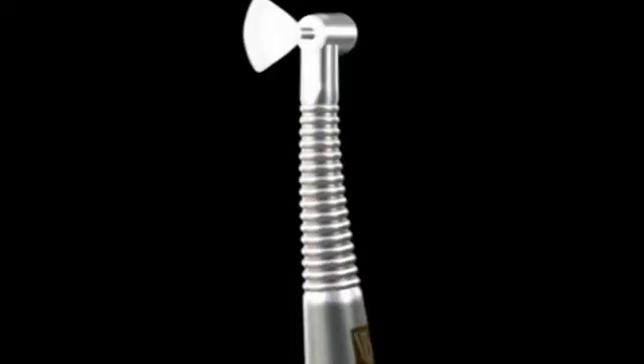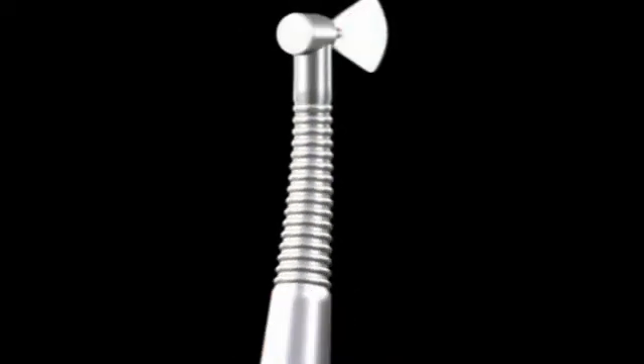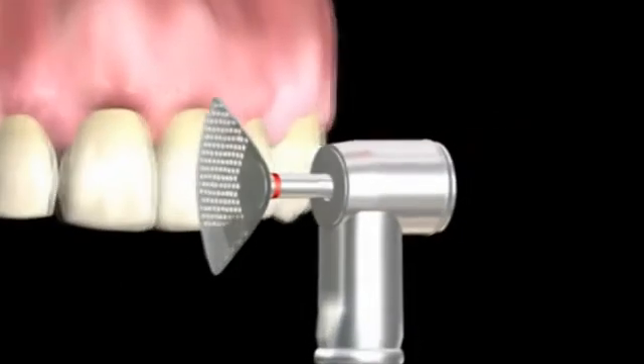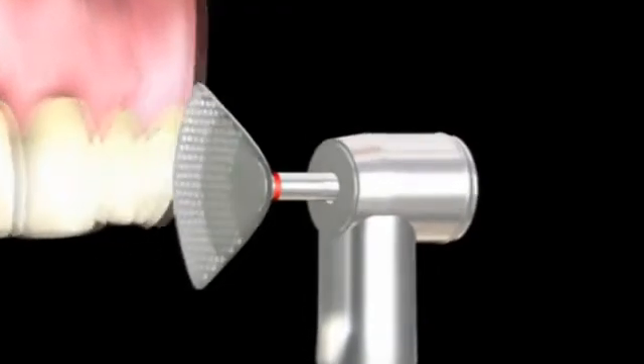The segmented discs are exclusively designed for use in the oscillating Comet contra-angle OS30 handpiece. There is a 6mm diamond coating on each disc, which produces excellent grinding efficiency.